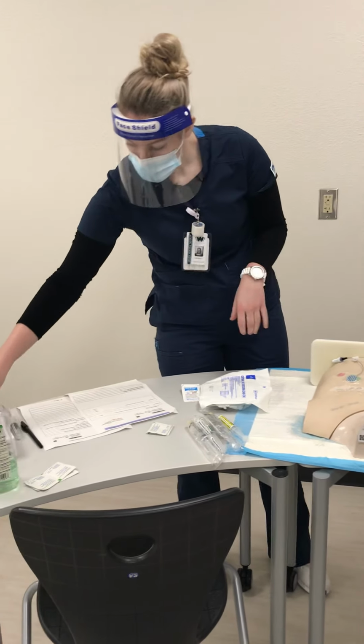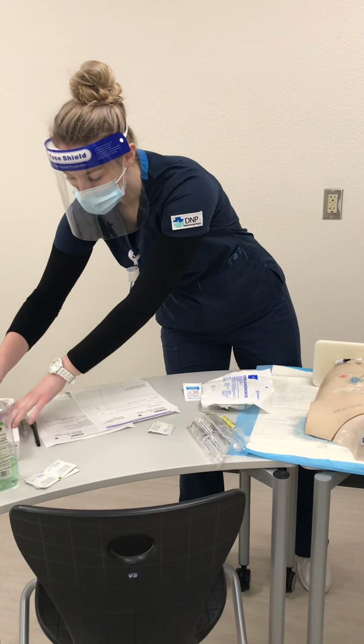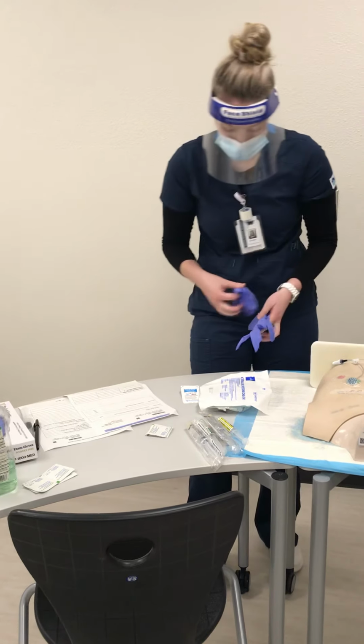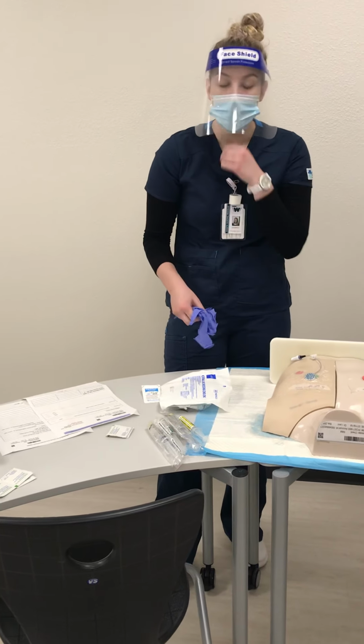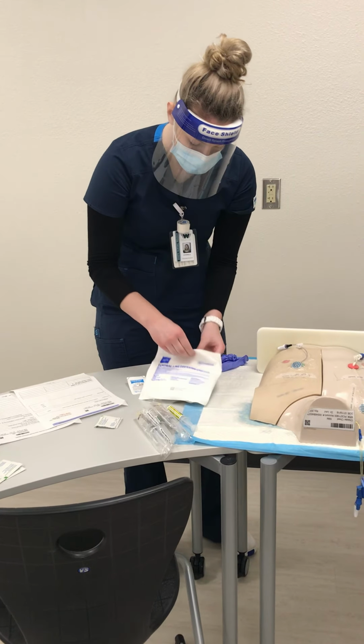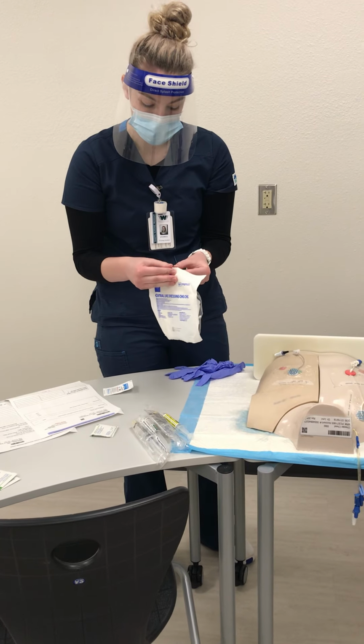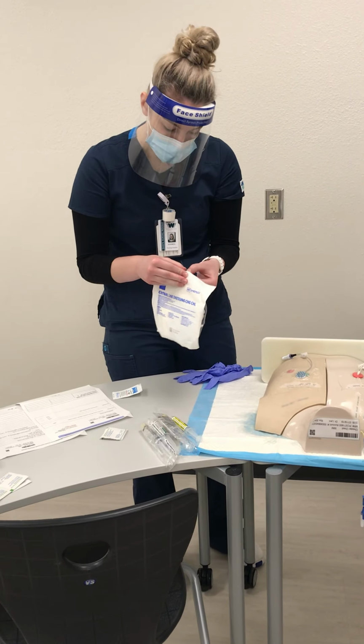So first we are going to, because we have to grab some things from the kit and add one thing in, I'm just going to open the kit. Normally we would have all the things in the kit and we wouldn't have to do this until we were ready to become sterile.